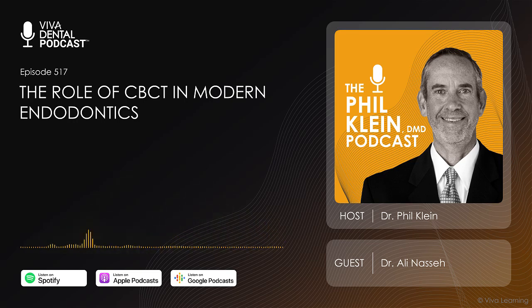Based on the first principles of the mechanism by which endodontics works, you can better decide whether this should be treated surgically, non-surgically, or just extracted because there's a hidden massive strip perforation on the side of the tooth, or sometimes you can see a crack on the tooth, but that's not quite as predictable.